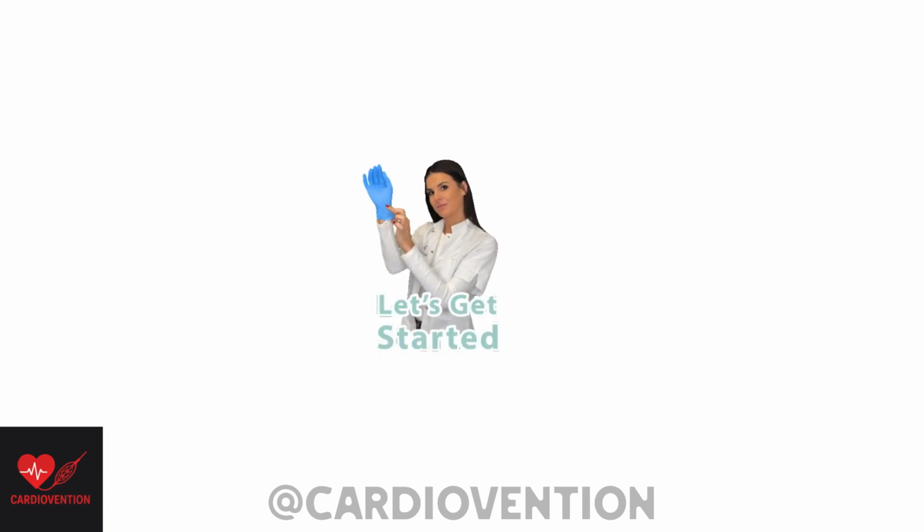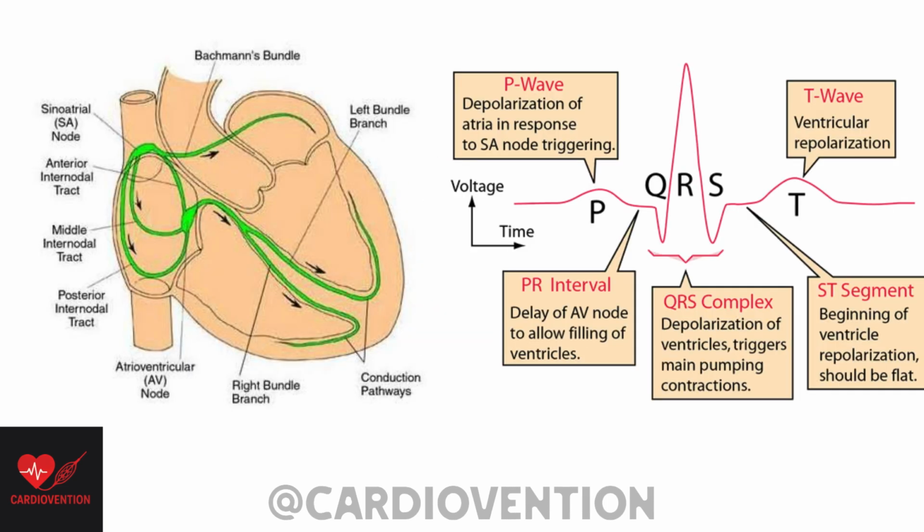Let's get started. The P wave represents atrial depolarization, the electrical activity that spreads through the atria. It begins at the sinoatrial node located in the upper right atrium near the junction of the superior vena cava. The impulse then travels across the right atrium and reaches the left atrium primarily through Bachmann's bundle. This smooth wave of depolarization generates the P waves on surface ECG.